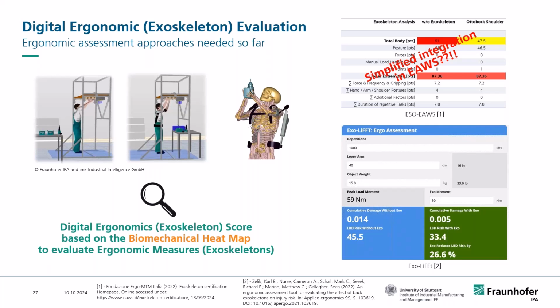But as Urban already mentioned, you can have a much deeper look into the whole musculoskeletal system and better understand what really happens if you apply an ergonomic measure, for example, an exoskeleton, to really see what happens in detail to the musculoskeletal system.